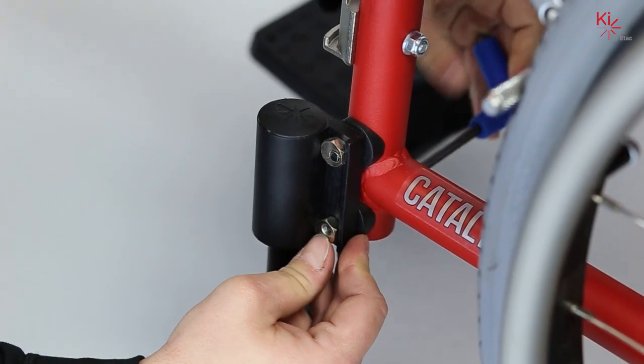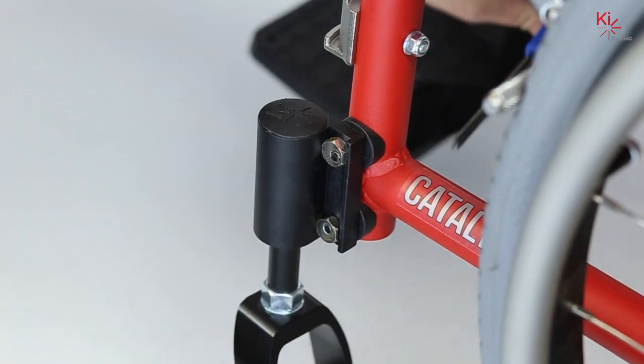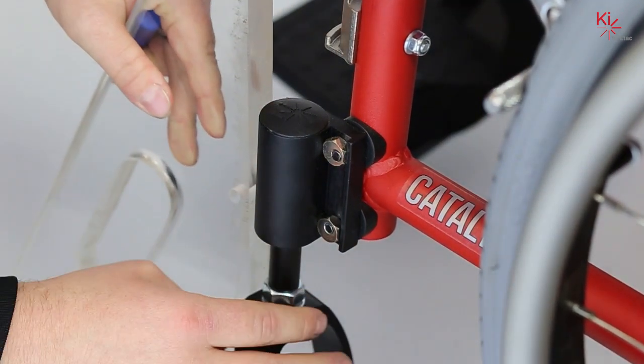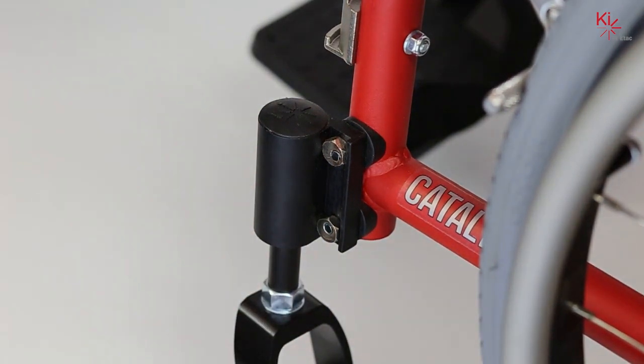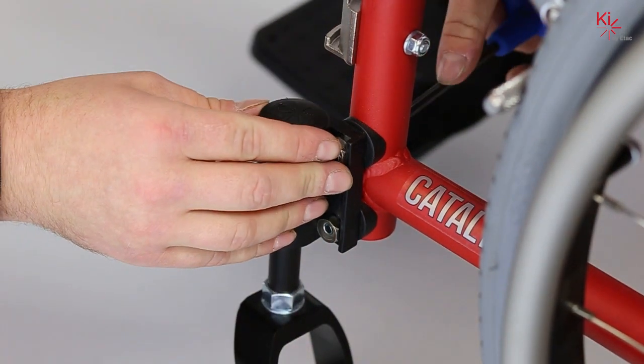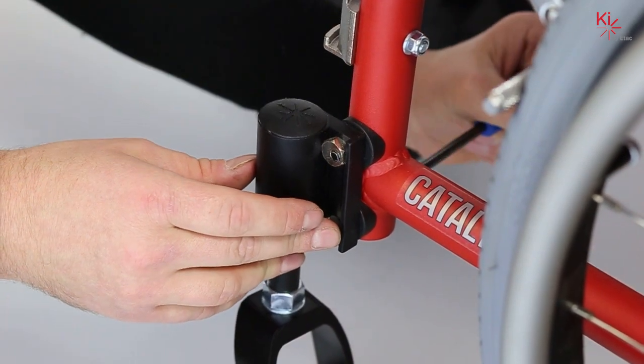Once secure, but not completely tightened, we will check for caster squareness. Once square, we will re-tighten the system until secure. Then repeat these steps on the next side.